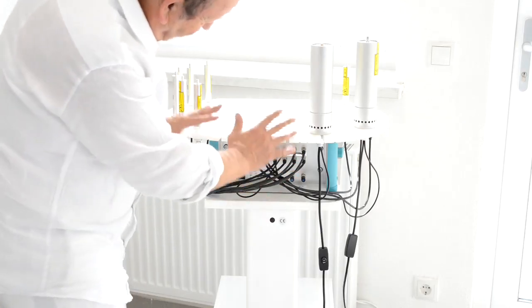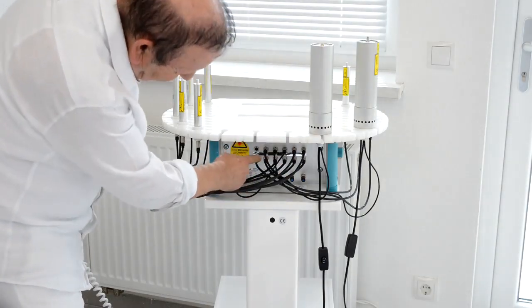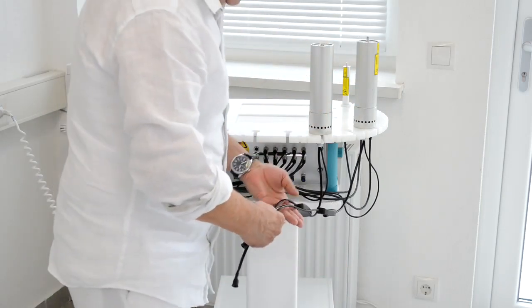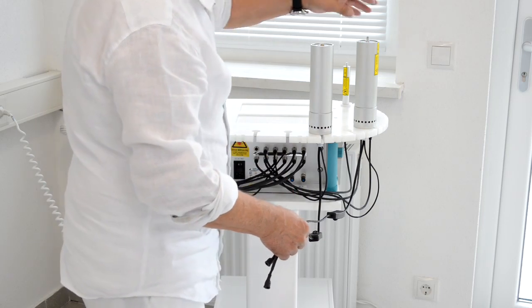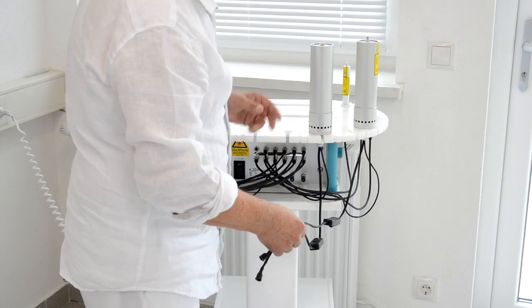Here you can see that all lasers are now connected to the device and plugged in. Here you can see 2 extra cables with connection. These cables belong to the yellow laser and the ultraviolet one.